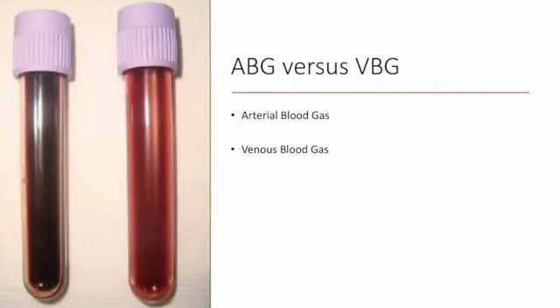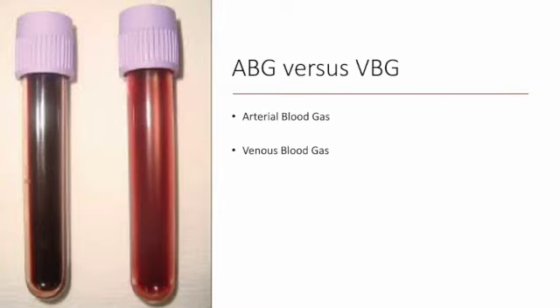So for example, you might report an ABG as 7.4, 35, 80 on a rate of 15, tidal volume of 500, PEEP of 5, FiO2 of 60%. Or if it was on a high flow, you might say 7.4, 35, 80 on high flow nasal cannula at 40 liters at 60%.